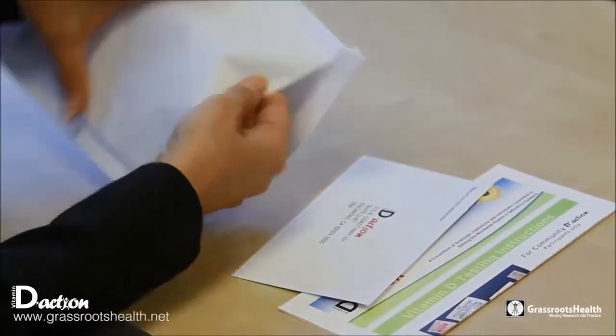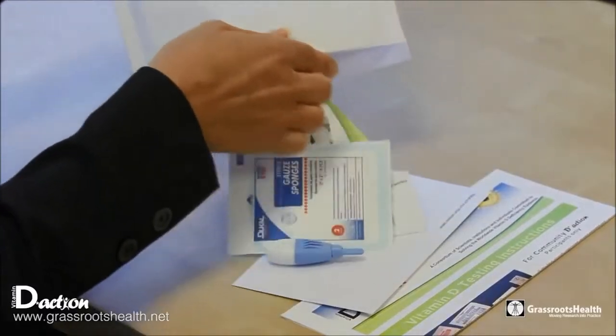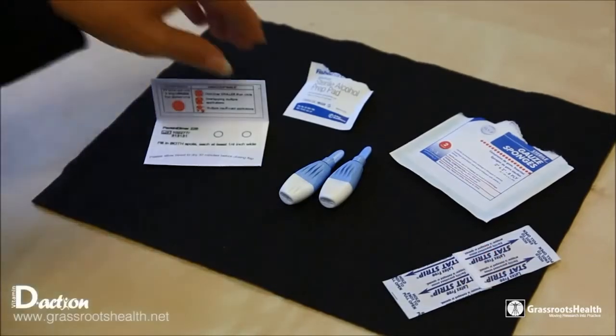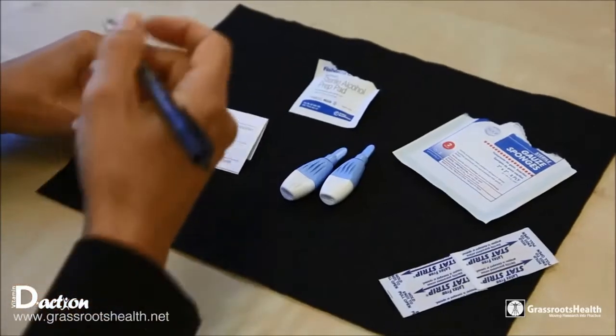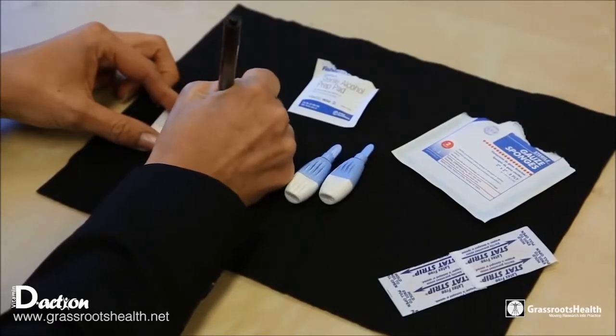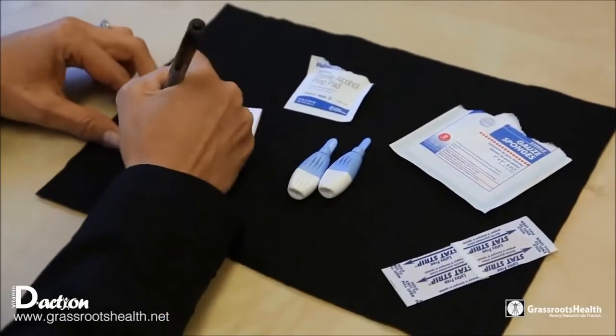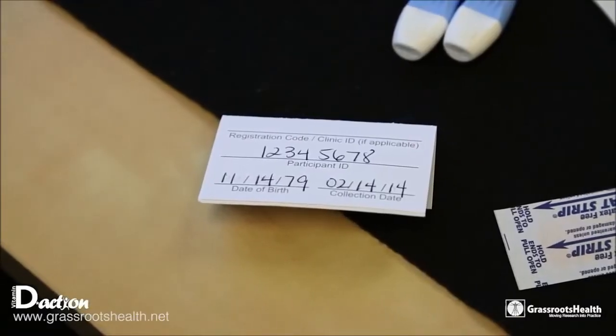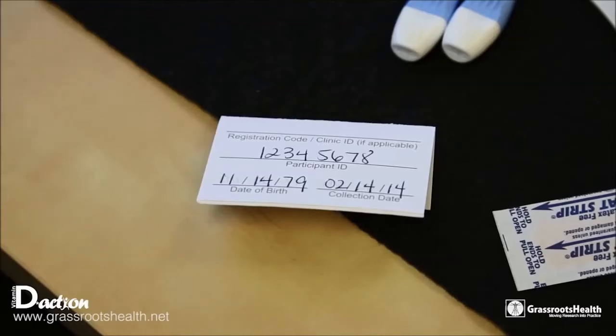The first thing you need to do from your kit is to have laid out all the pieces in this order: the blood spot card on the left, then an alcohol swab, the two lancets, a gauze pad, and a band-aid. Pick up the blood spot card, and on the back, write in your participant ID, which you get from logging into your account, the date of birth, and the date of collection.